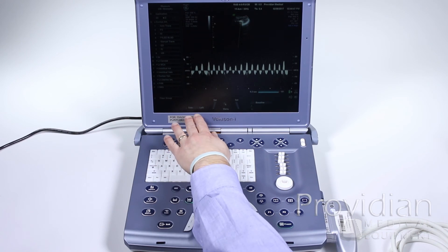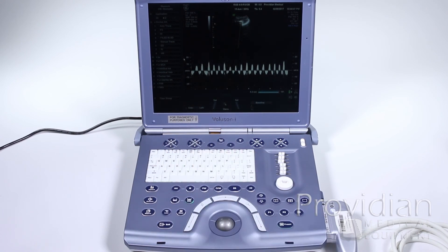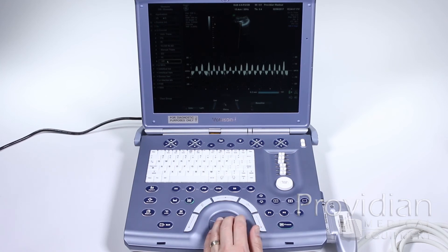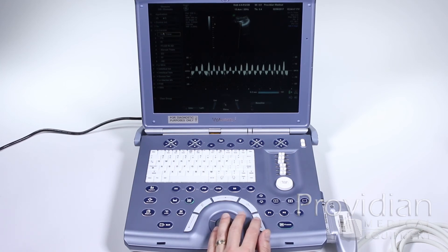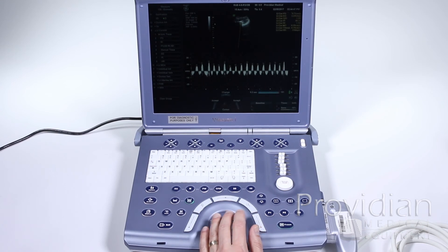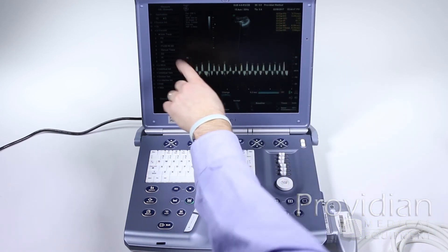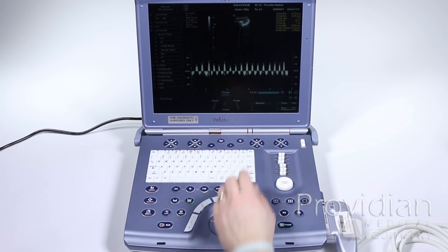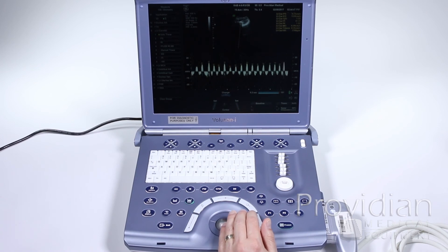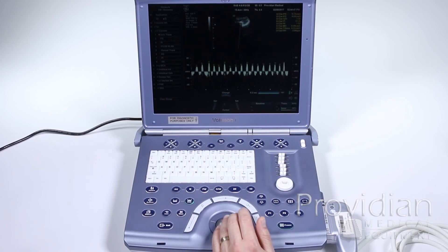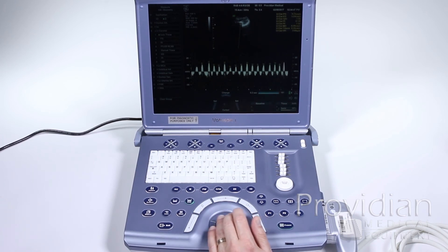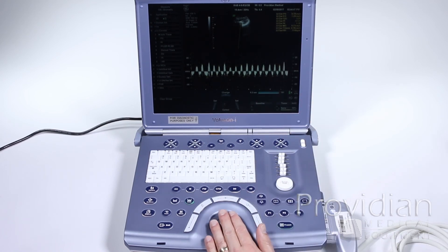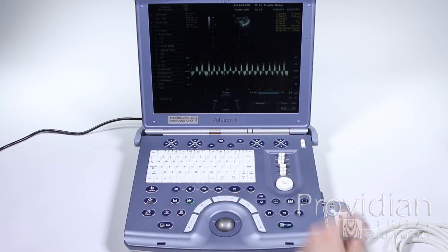Let's say I'm doing a carotid — I can choose the left or right side. I'll choose auto trace and select carotid since that's what most will do. The auto trace will automatically calculate everything for you, so it says left carotid as selected. I can click accept, and then change the values by scrolling the trackball. You'll see the values change as I scroll and I can choose my peak and end.